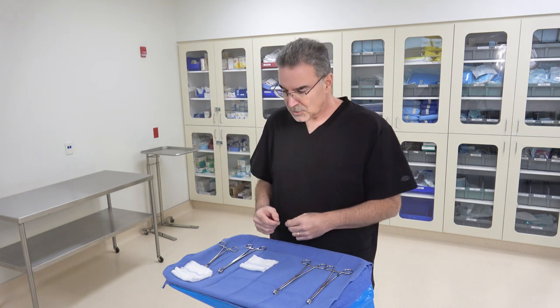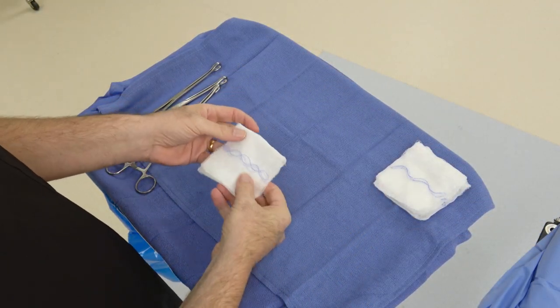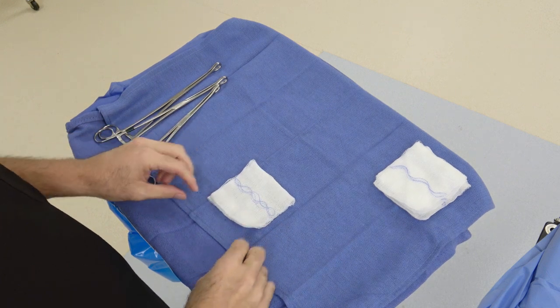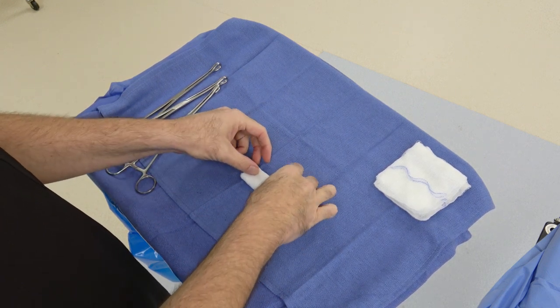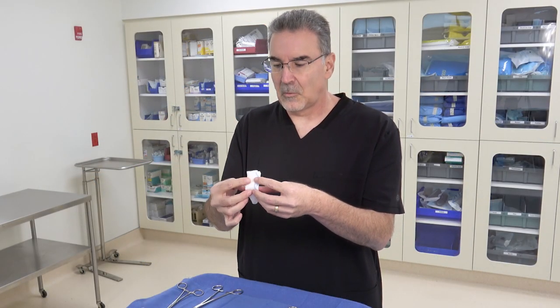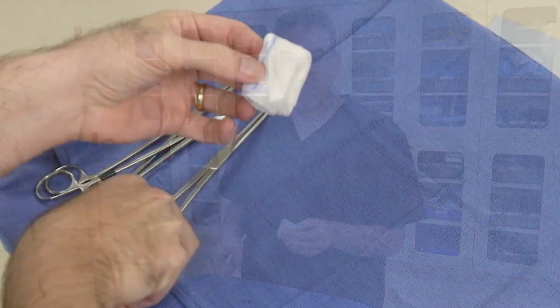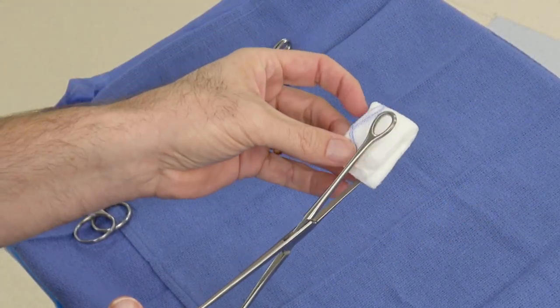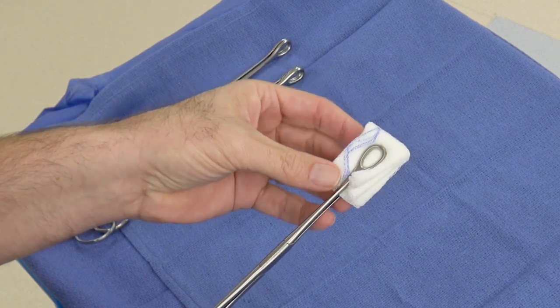For the first method, which is the most straightforward and probably the fastest way to create a sponge stick, we take our RayTac and fold it into thirds — one third and then a second third. Then with the blue stripe on the outside, we fold it in half lengthwise. Then we simply take our sponge stick and clamp it onto the RayTac, just like that.